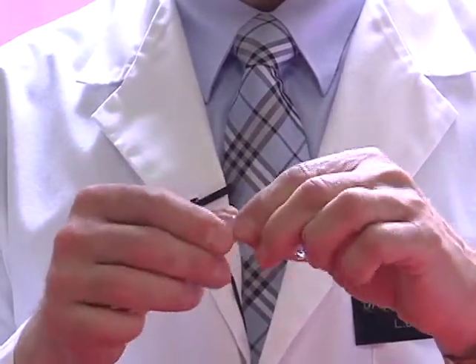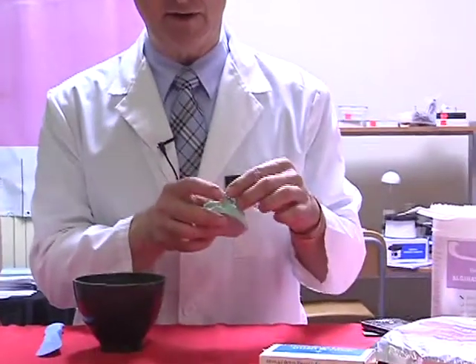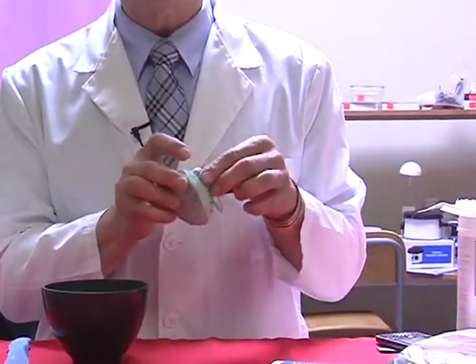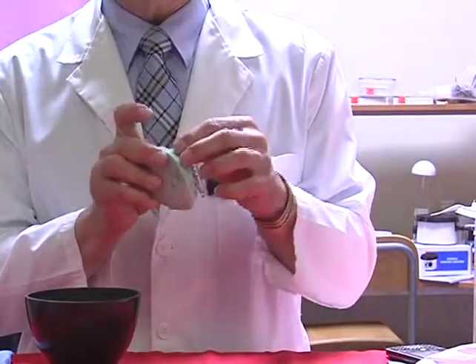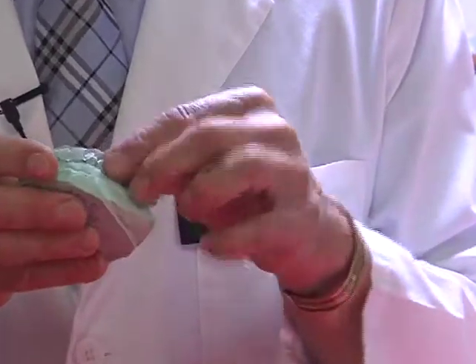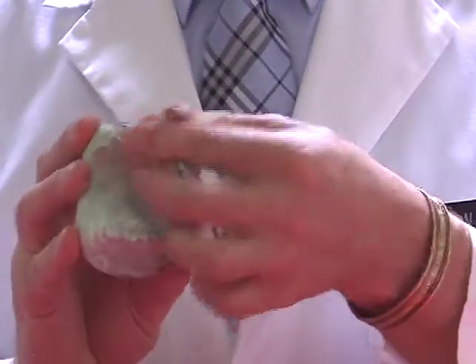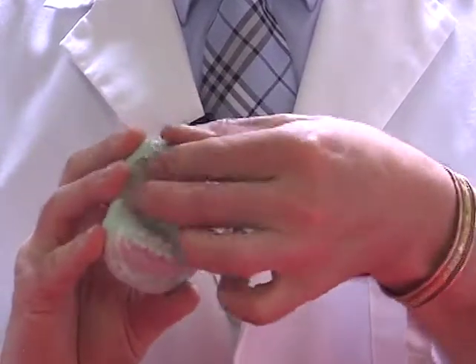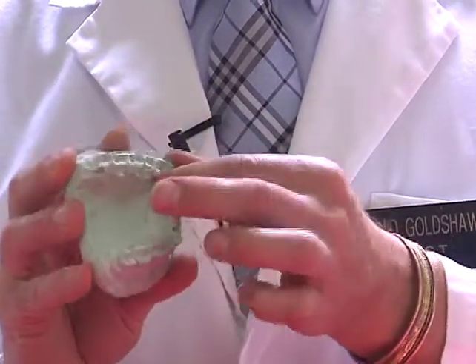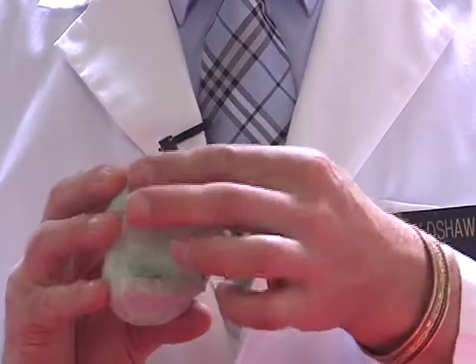At this point then, I would then roll it out into a small thin sausage and adapt it down over, directly into the patient's mouth, over the teeth. So all we'll be using is our gloved fingers with a light pressure, placing it down over the teeth. As I'm adapting it down over, like so, slight pressure, so the patient just feels a nice warm material. It's not hot, it's just warm to work with.